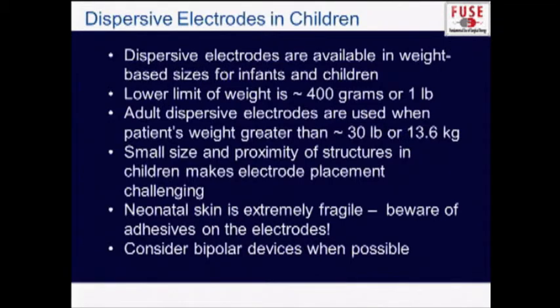If for some reason, and I've had this problem operating on a 500 or 600 gram baby, you could not get the dispersive electrode on in a way that the generator would say that it was okay, in that case you should use a bipolar device.